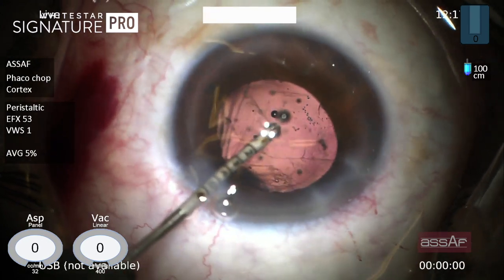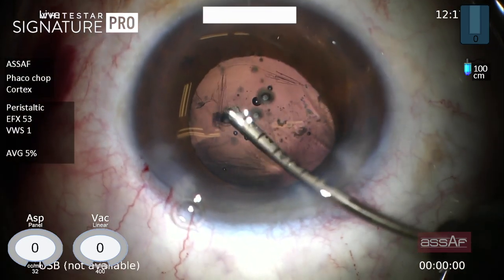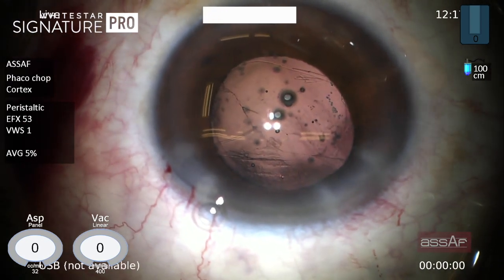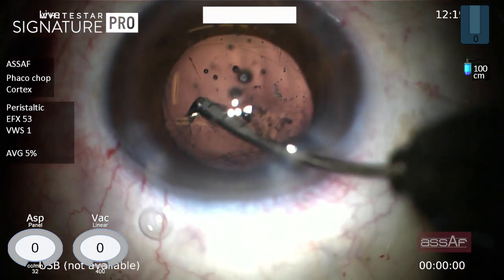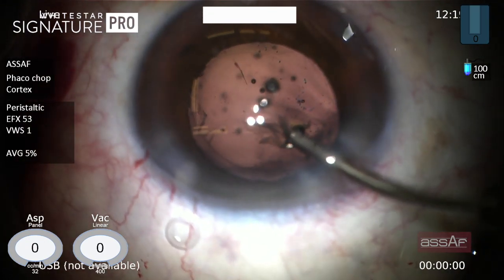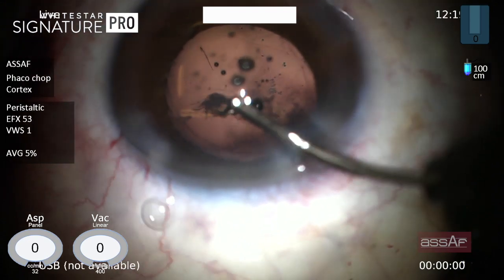Now someone can argue leaving those cortical fibers on the posterior capsule and doing YAG laser later on. However, I don't like to leave my patients with compromised vision after cataract surgery for a few months before doing YAG laser.